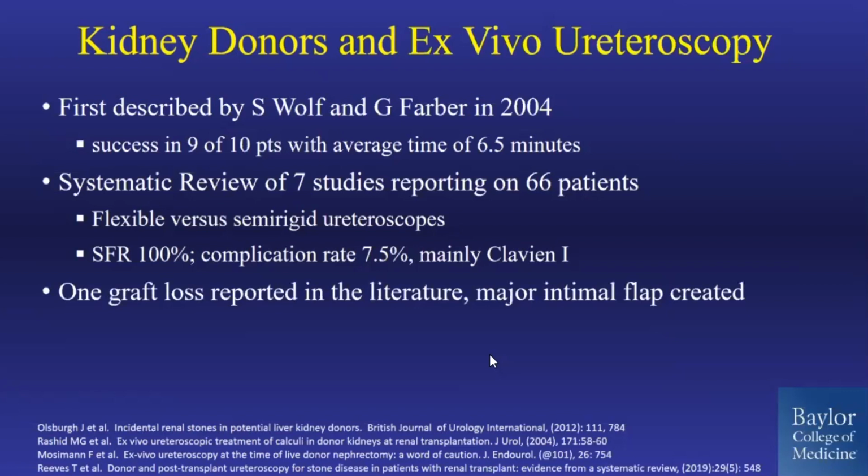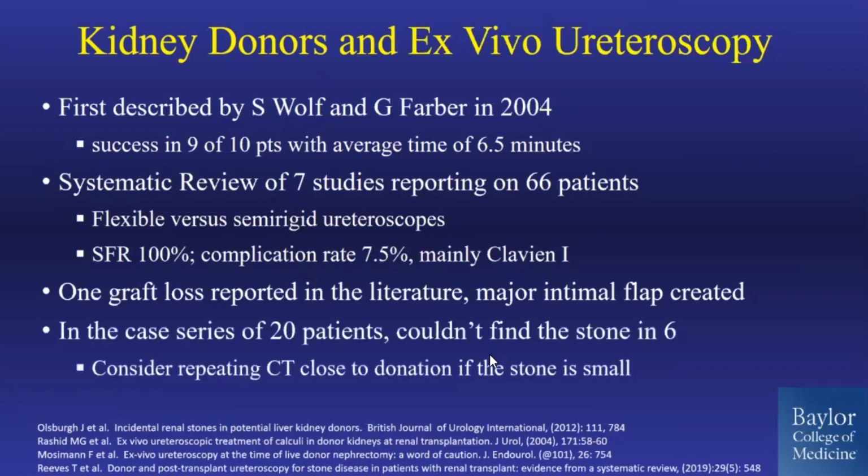There was a case report of a graft loss during ex vivo ureteroscopy, however. There are also instances, and I know this has happened to me, where you just can't find the stone, and one presumes that if it was a small stone, they passed it. So there's a recommendation that maybe you ought to make sure your CT scan is pretty fresh to the donation.